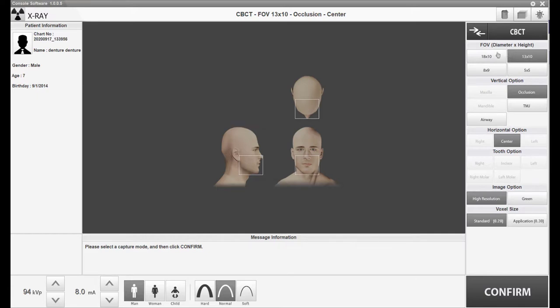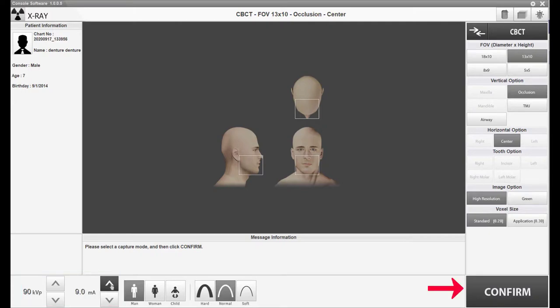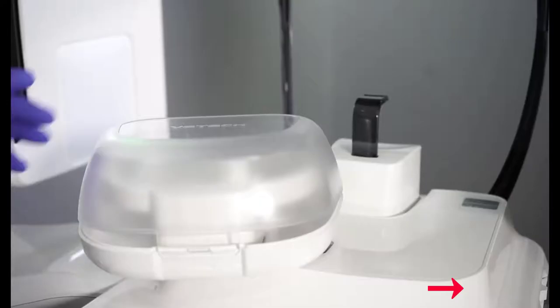After selecting your FOV size, change the KVP to 90 and the MA to 9, and then select Confirm.